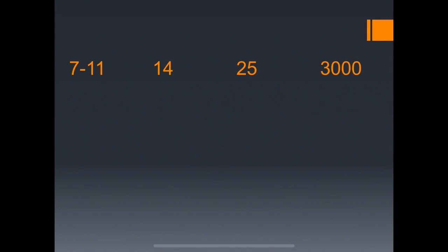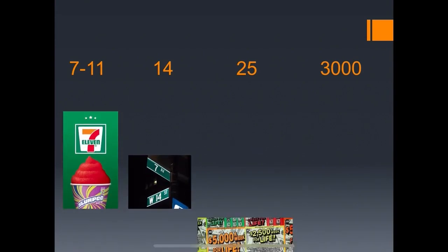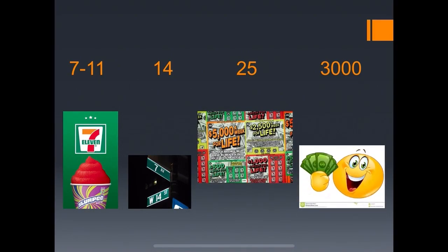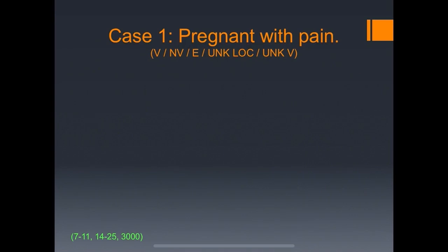You basically have to put these numbers to memory in order to interpret first trimester pelvic ultrasound. My memory tool is: I went to 7-Eleven on 14th Street, played $25 in scratch-offs, and won $3,000. You're welcome to use it or make up your own. We're going to go through eight cases, trying to say: is it viable, non-viable, ectopic, unknown location, or unknown viability?